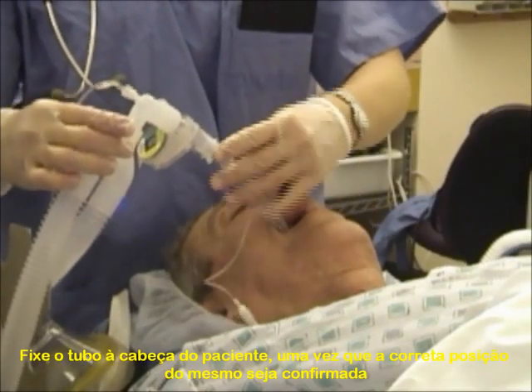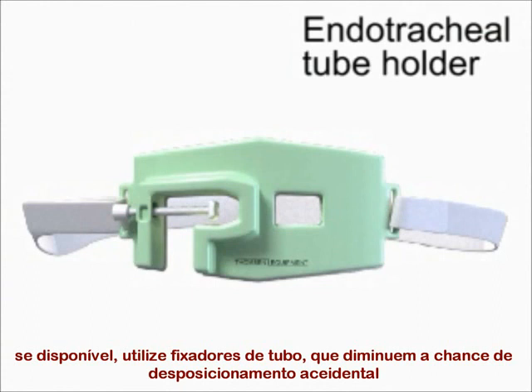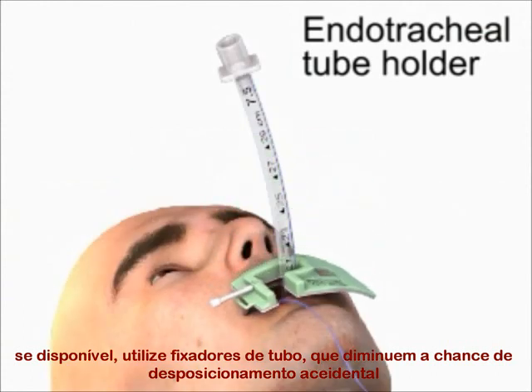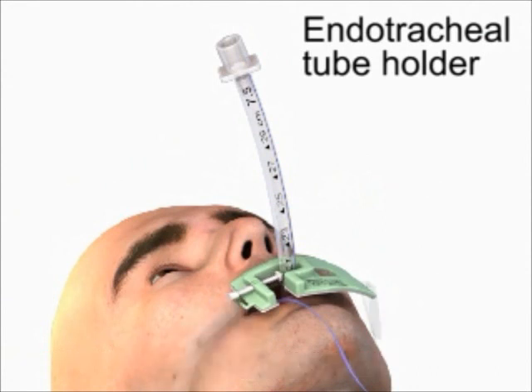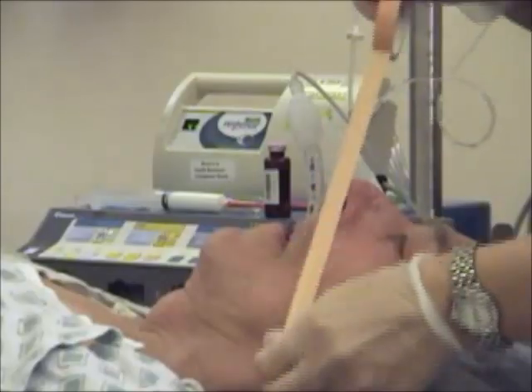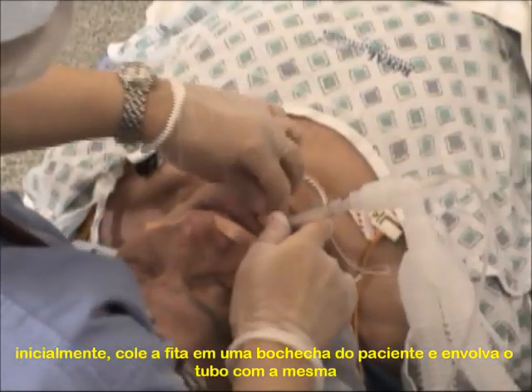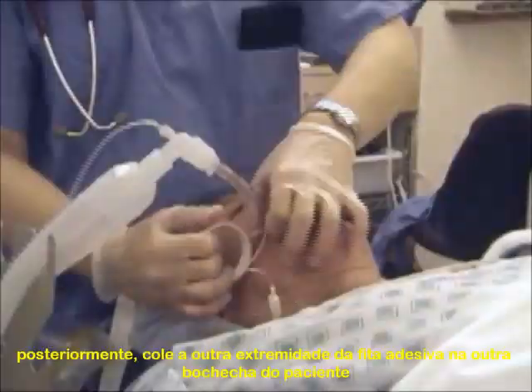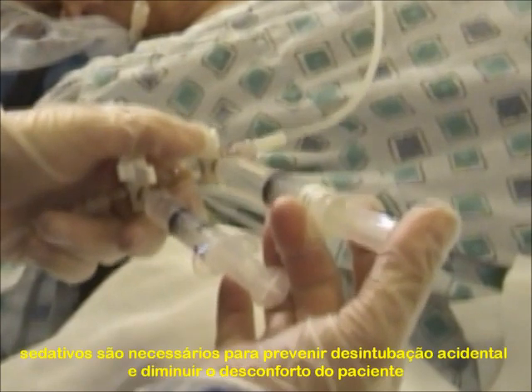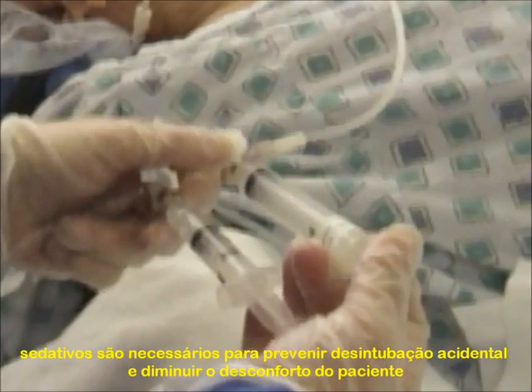Secure the endotracheal tube to the patient's head once proper position has been confirmed. If available, you should use an endotracheal tube holder to secure the tube, as these devices aid in the prevention of accidental displacement. If such a device is not available, tape may be used instead. First, attach the tape to the patient's cheek and then wrap it circumferentially around the tube. Next, affix the free end of the tape to the patient's other cheek. Pharmacologic sedation and hand restraints may be employed to prevent inadvertent extubation.